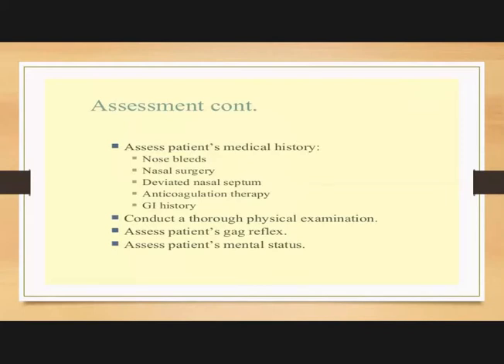Okay, after that, what will we do? We will assess the patient's medical history: if a patient has nosebleeds, nasal surgery, deviated nasal septum, anticoagulation therapy, and GI history. And conduct a thorough physical examination. Assess the patient's gag reflex, and assess the patient's mental status.